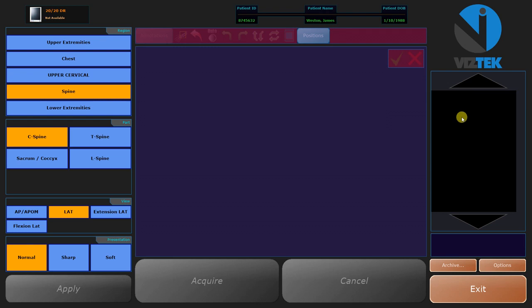And if you wanted a second image, once it's loaded in, all you do is come over here and select the next shot. Set up the patient, then hit Acquire. Again, it will count down those 30 seconds, and that will give you the 30 seconds to shoot that x-ray.